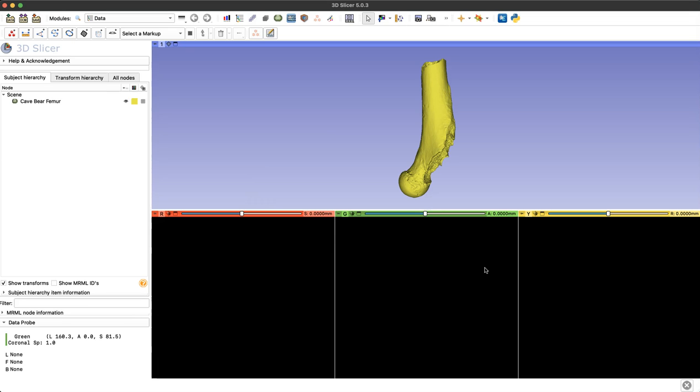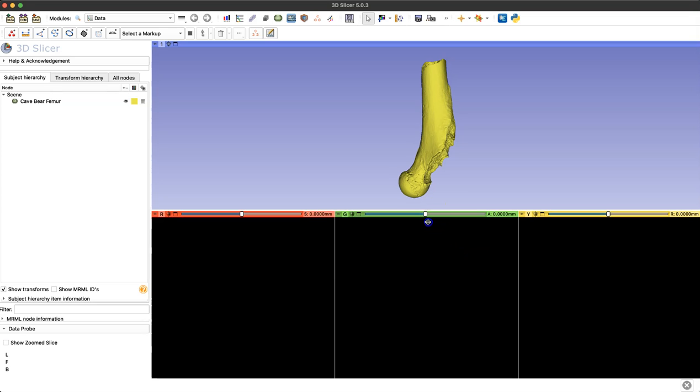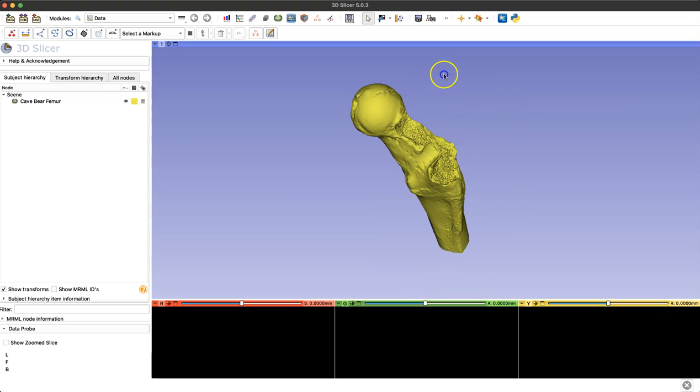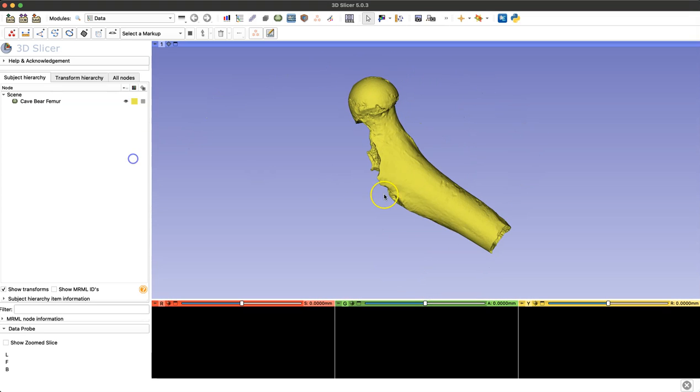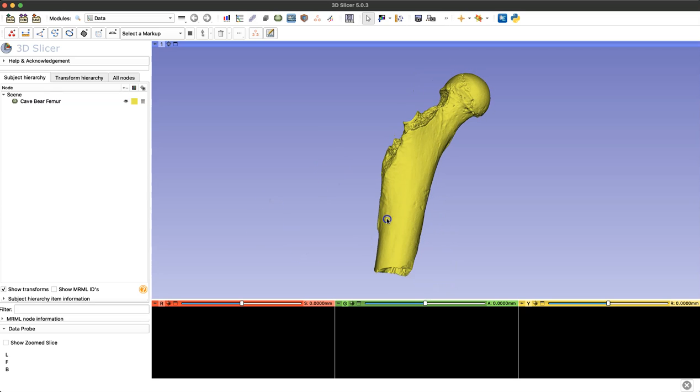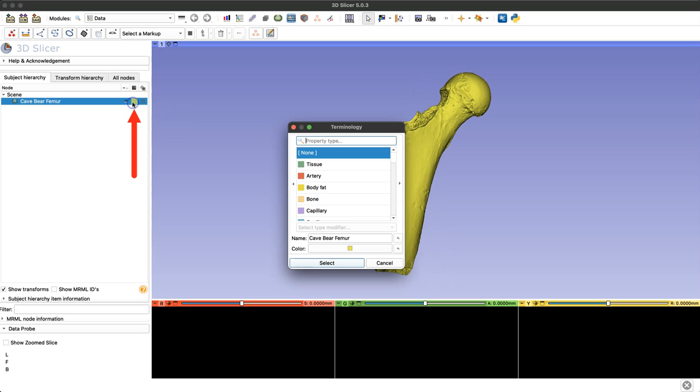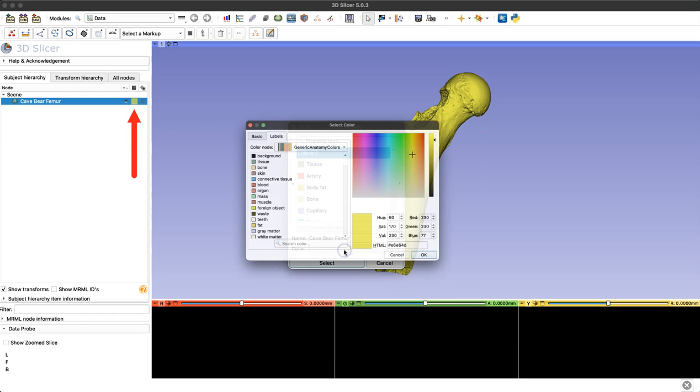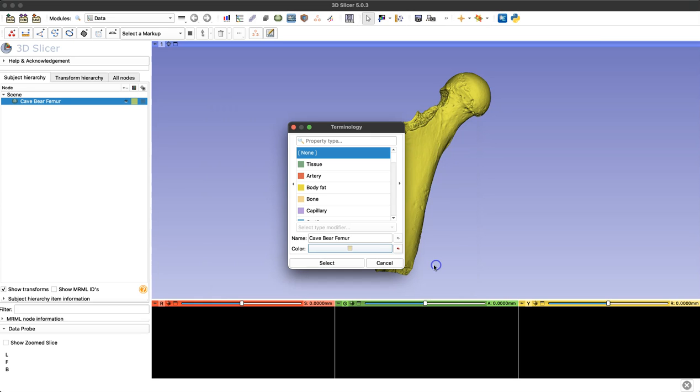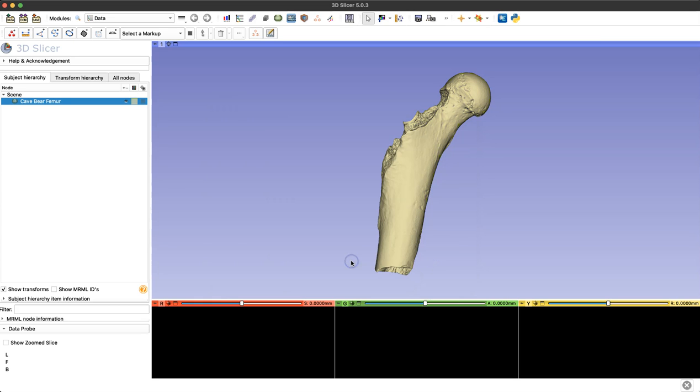Now I can make a few changes to the screen here. I can lower the three perspectives so I can see my 3D viewer better and look at my model. I can also change the color of my model by simply clicking that colored square next to my model name in the left side menu, and I'm just going to choose something a little closer to natural bone color and leave it at that for today.